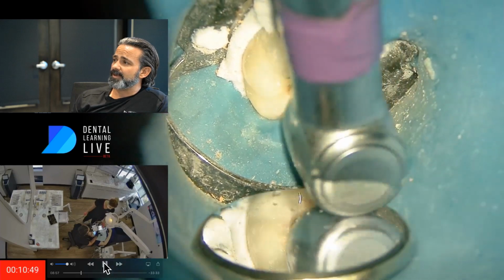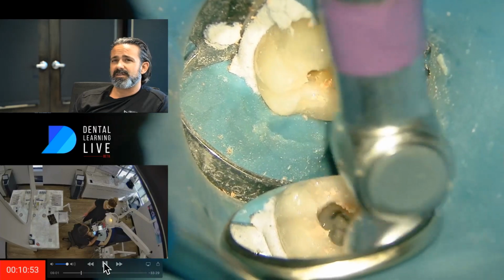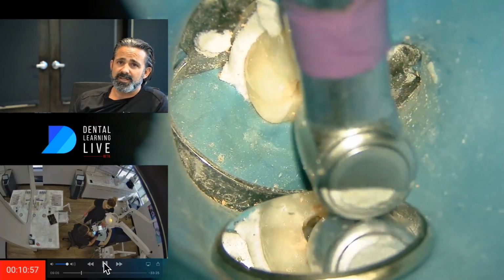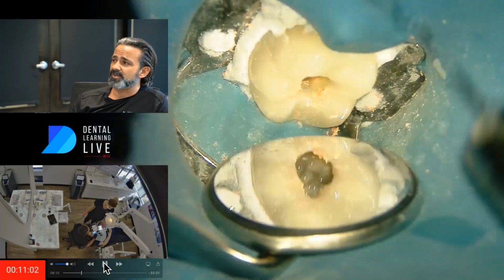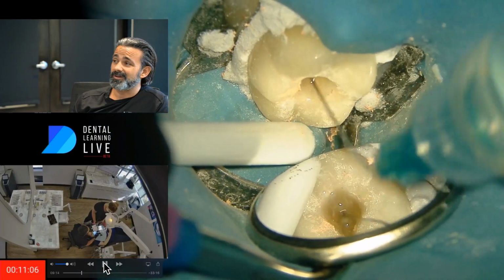So we're picking and working, and you know what? There's going to be a decision tree here in a minute. Once I get this all out, I'm going to take a working length X-ray and perceive where things are at. Especially like, did I go long?